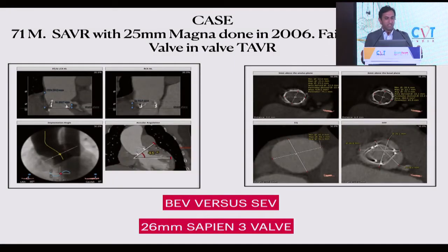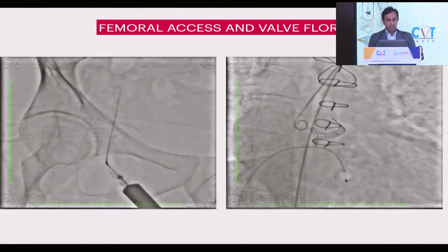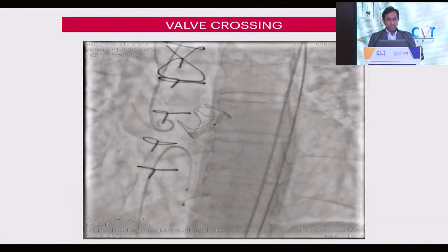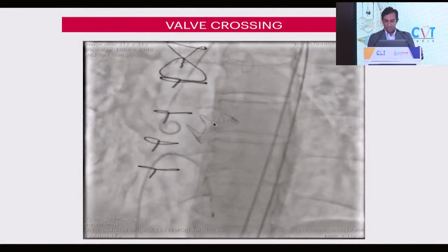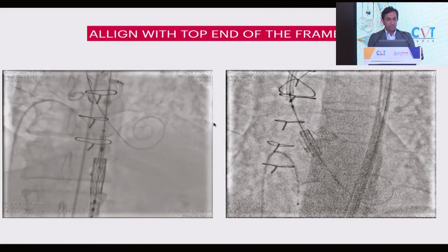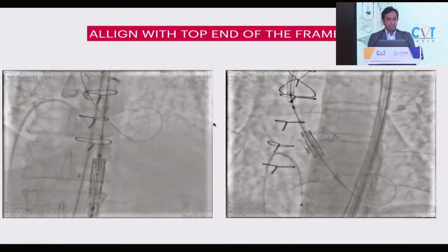Let us look at a case, 71-year-old male, surgical AVR with 25 Magna, done in 2006, failed in 2021, comes for a valve-in-valve TAVR. Balloon expandable versus self-expandable. Now, you see, the previous surgical valve is 25 millimeter, and the balloon expandable which we can use in this case is a 26 millimeter. And that is why, because it's a larger anatomy, I've chosen a 26 millimeter balloon expandable Sapien 3 valve. Sometimes crossing a failed bioprosthetic valve can be a challenge because the opening can be very eccentric.